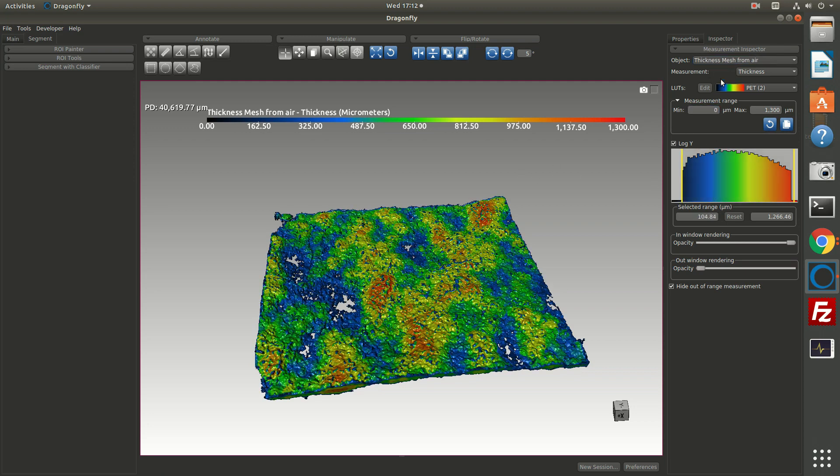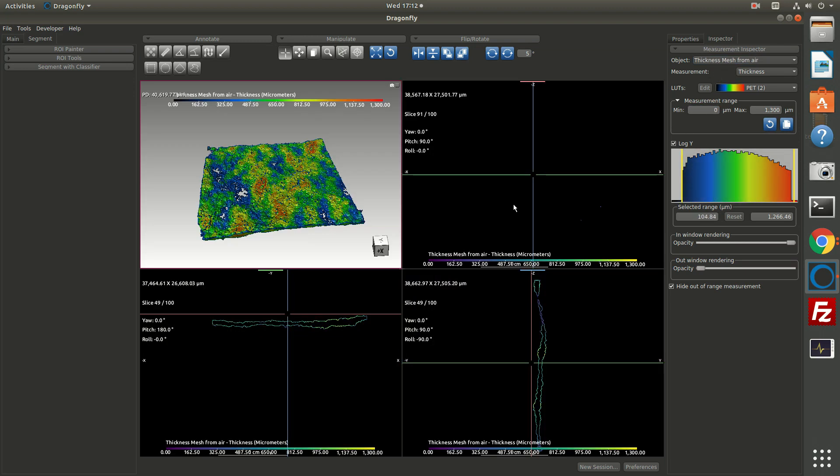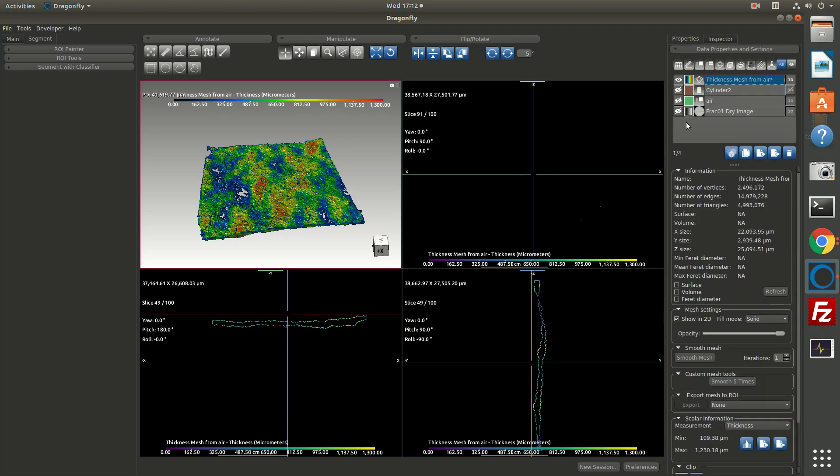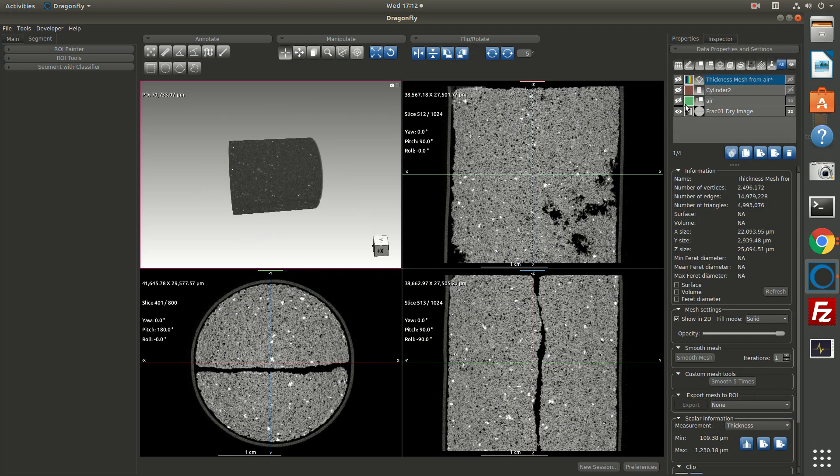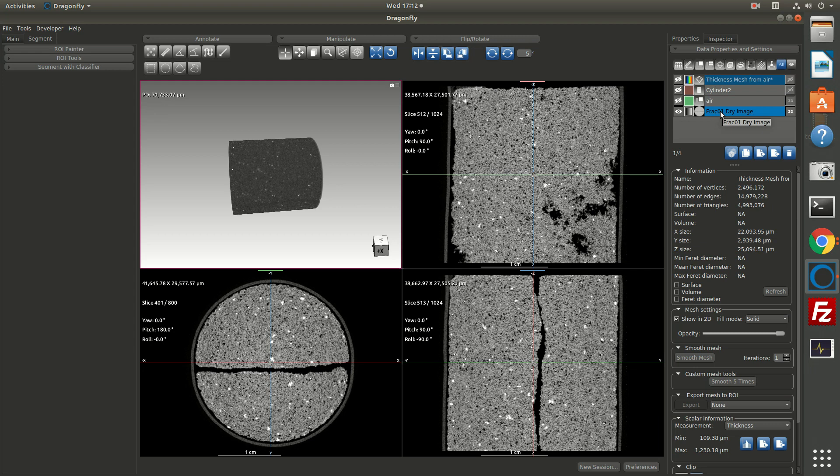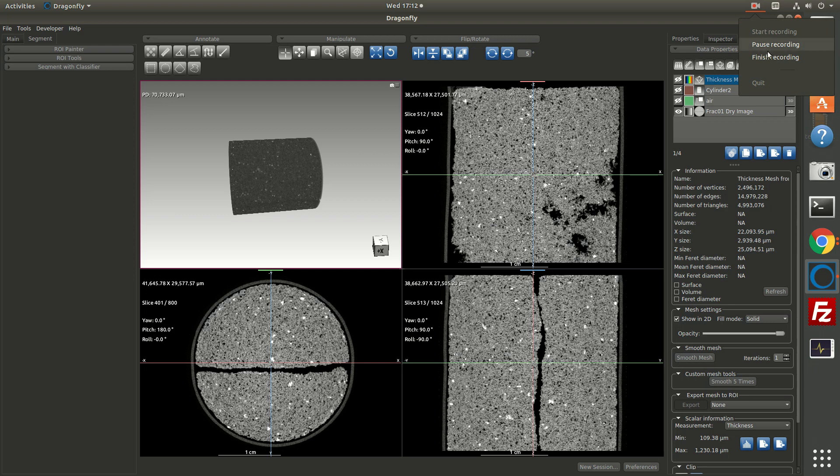All right, so that's the end of this video, which gives you a brief introduction to a little bit on shapes, a little bit on regions of interest, and then a little bit on the thickness mesh, all using that Berea Sandstone Fracture sample from Digital Rocks Portal. All right, enjoy.